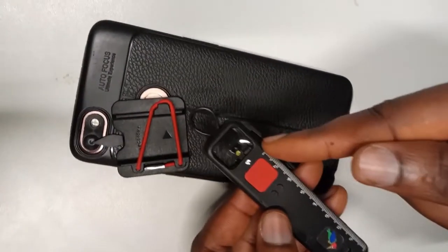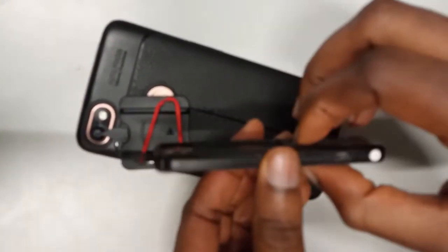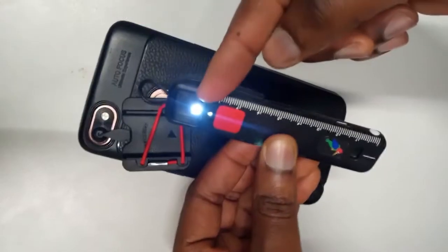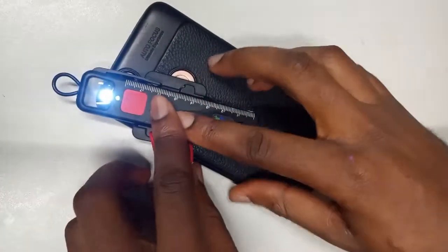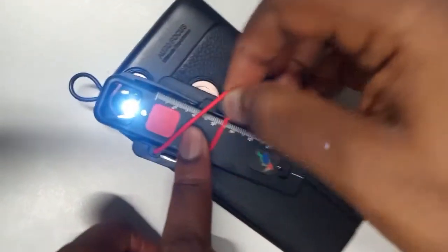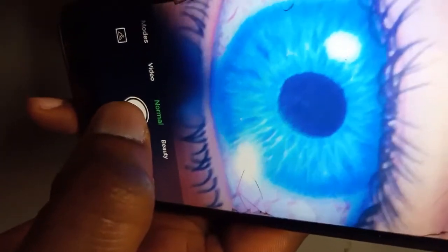For anterior segment imaging, we make use of the magnifier portion. We click the power switch four times to get the dimmest magnifier light — one, two, three, four — and it takes us to this light. You place it this way: this part will be on top, and this portion will touch here. So we loosen this, place it, and drag until here touches here. Till it touches, like this. Then you clip to hold it. So you can get a magnified view of the anterior segment by going directly to your phone camera.